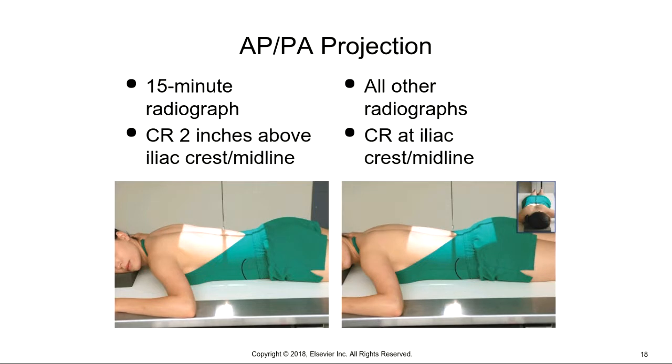Okay, if you look on page 494, under the purpose, it says the purpose of the small bowel series is to study the form and function of the 3 components of the small bowel and detect any abnormal condition. Because the study examines function, it has to be timed. All right, this isn't the only functional study. When we've talked about an IVU or an IVP, where we look at the urinary system, that is also a functional study. So anytime it's a functional study, there has to be time involved.